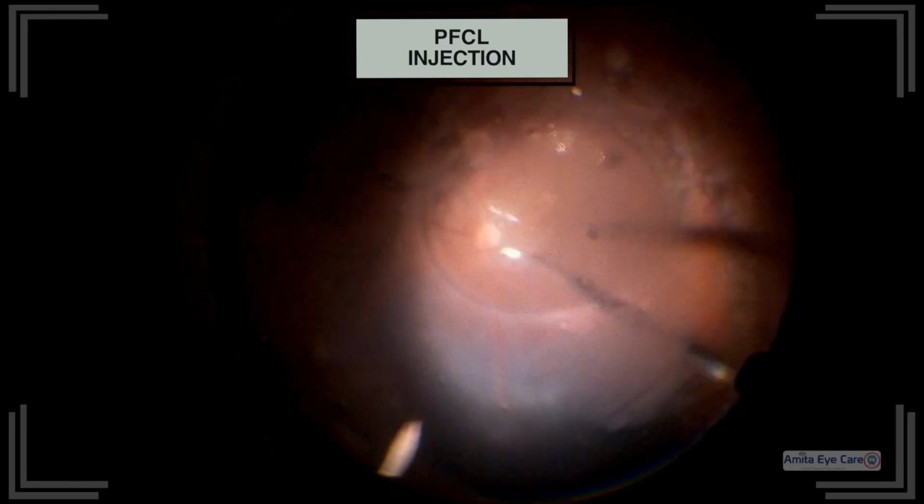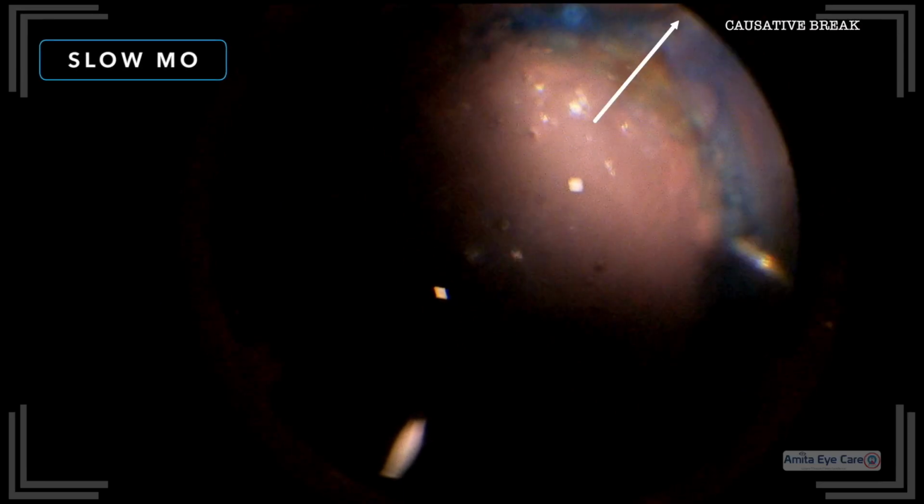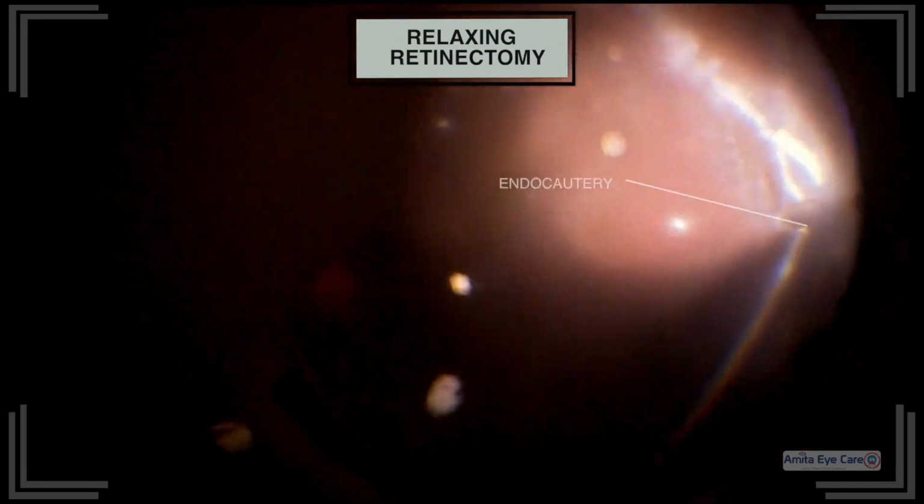PFCL was injected to displace the dye to the retinal periphery and the plume of the dye was noticed emanating from the now visible break. We show this again in slow motion. A relaxing retinectomy was done followed by endolaser, fluid air exchange and silicone oil injection.